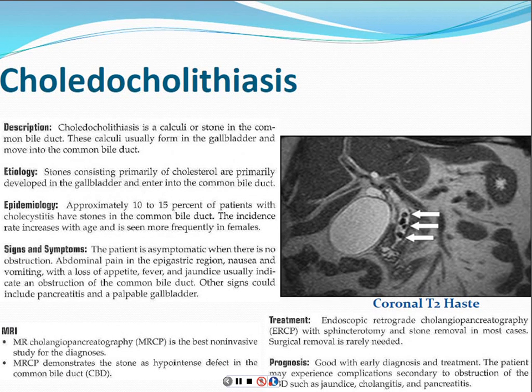And this is not something that we're good at detecting with any other study. If we do an ultrasound, frequently, because of where the common bile duct is, surrounded by stomach and small bowel, it's often obscured, and we frequently can't see the whole duct in order to see if there are any stones in it. Even if we do see the whole duct, you can't always confidently say that there isn't a stone there just because you didn't see one. And CT is not useful for detecting choledochal lithiasis most of the time because most gallstones are not dense on CT. They won't even show up.